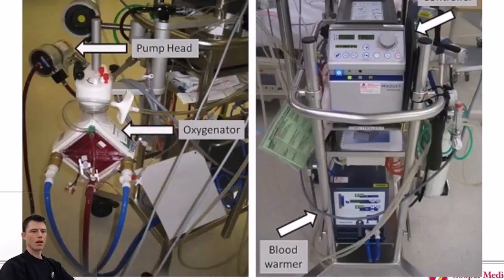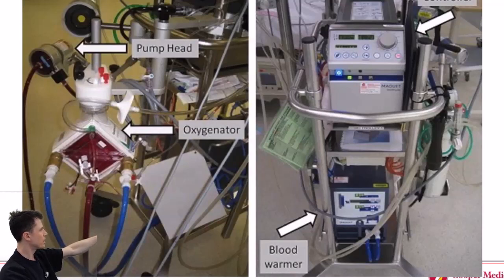All right, so this is kind of pictorially, you guys have seen this. The controller up on the top right controls the RPMs of the pump. We have the blood warmer down there. We have a pump head. And we have an oxygenator.